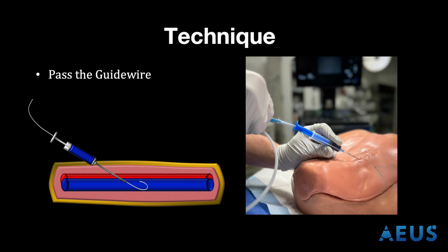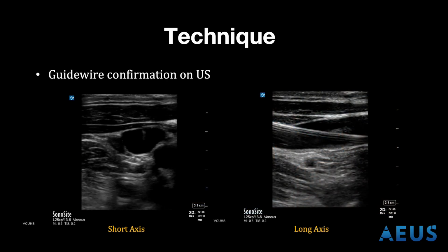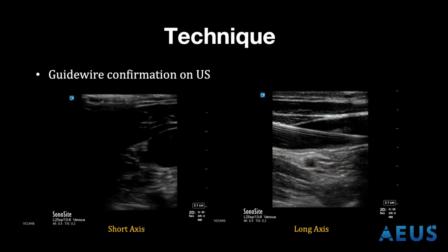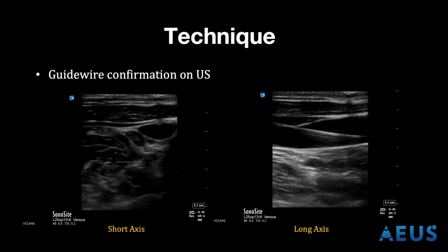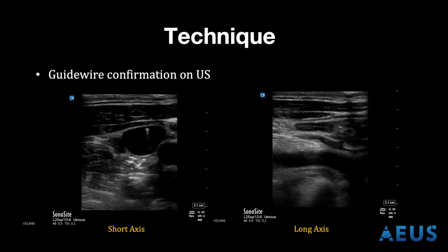Traditionally, the guide wire will be inserted directly through the needle and into the vessel body. However, if you have one of the unique syringes shown in the picture here, you can actually pass the guide wire directly through the syringe, eliminating the need for the removal step, which can sometimes cause dislodgement of needle positioning. Once your guide wire is in the vessel, you can remove your needle and the guide wire will remain in place. This is known as the Seldinger technique.